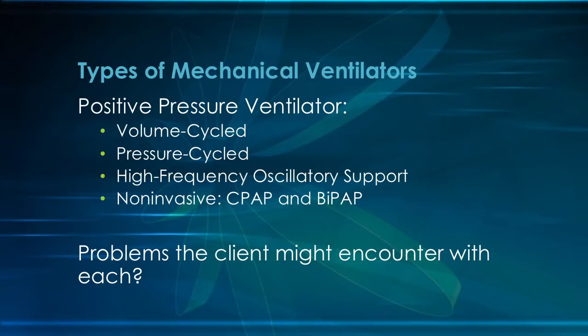We also have non-invasive ventilator modes, and those are CPAP and BiPAP. CPAP is continuous positive pressure versus the bilevel positive pressure. Both of them require our patients to breathe on their own, and they can have an independent control, either inspiration or expiration.